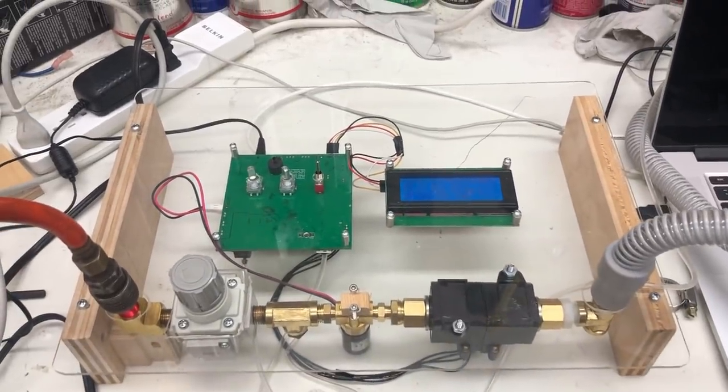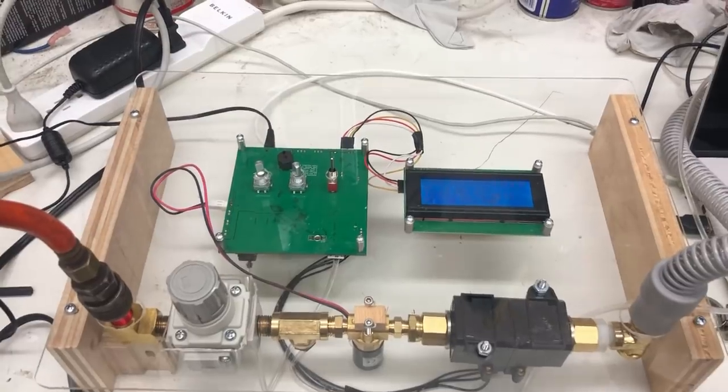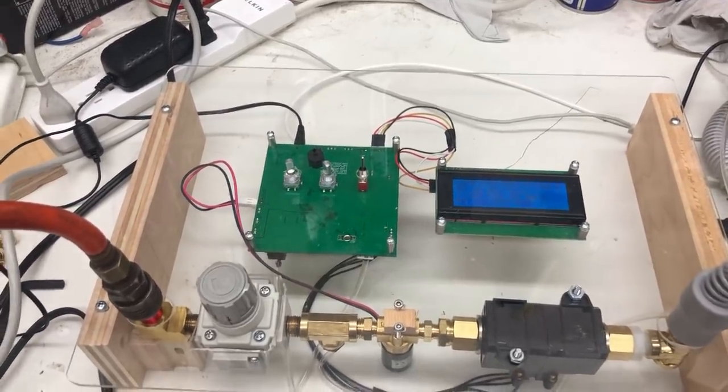So you see here the unit is running. It's very precisely metering air and oxygen, so you're getting the pressure and flow of the air to the patient.